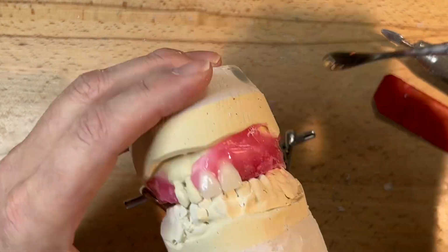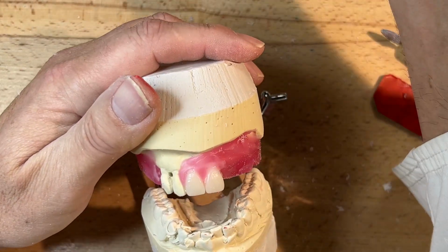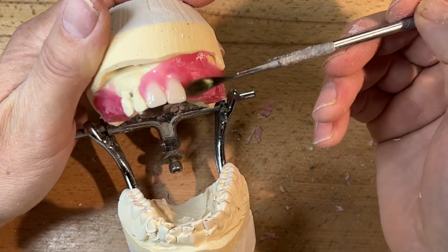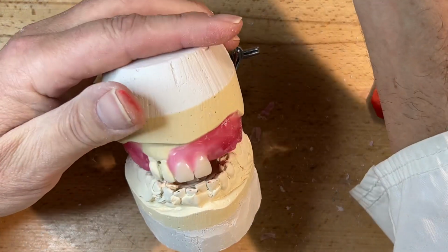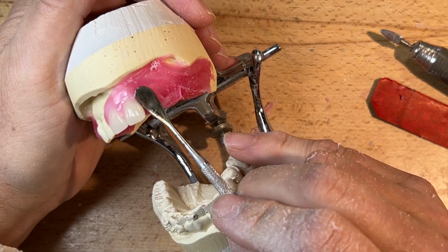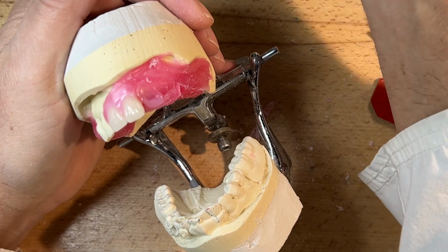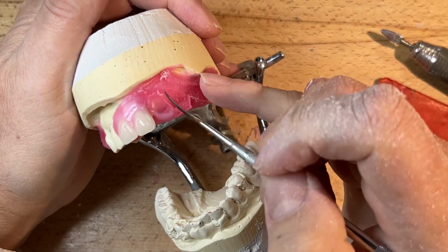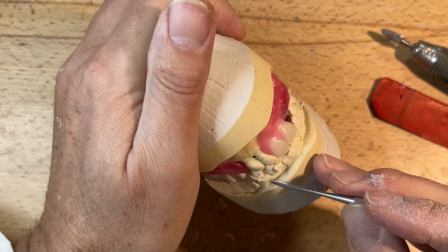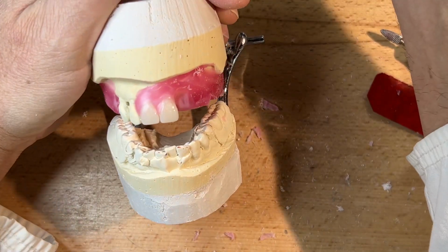And once I'm happy with my location, I'm going to secure now the two centrals, maintaining the midline, maintaining the emergence angle, and then I'll move over to the lateral. I've never done this case before, but I'm approaching them all the same way. I'm assuming that from my tooth selection, I'm going to end up in a class 1 relationship with this canine, as such over here with the natural canine between 3 and 4.